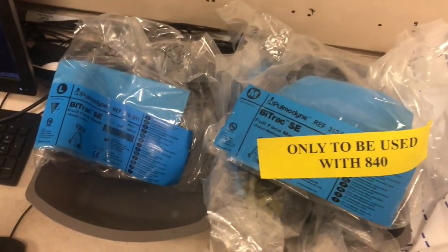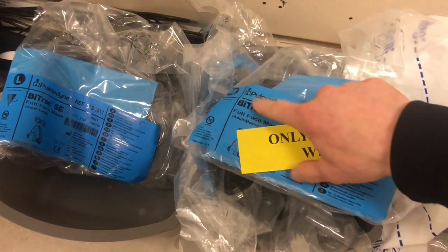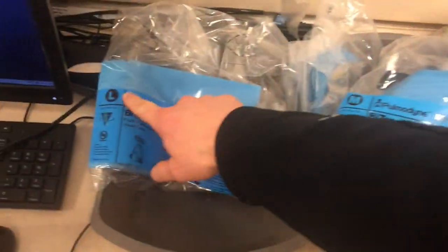Looking at the BiPAP mask, trying to figure out what size they are — it's right here: medium, large.